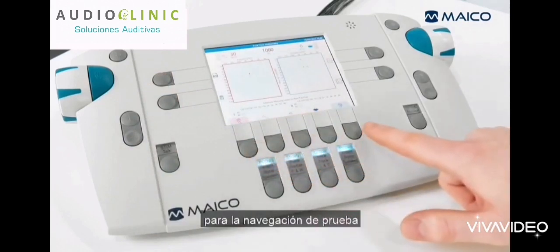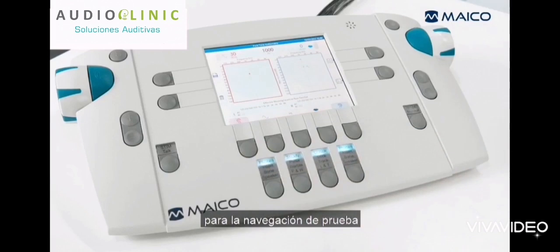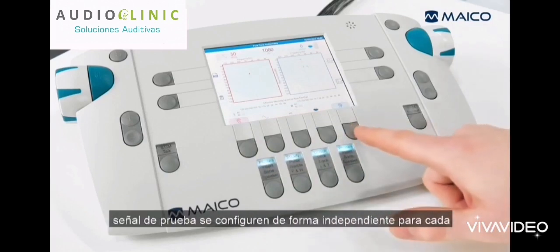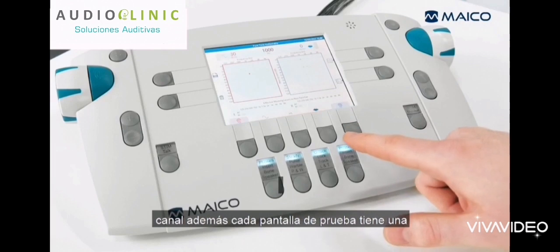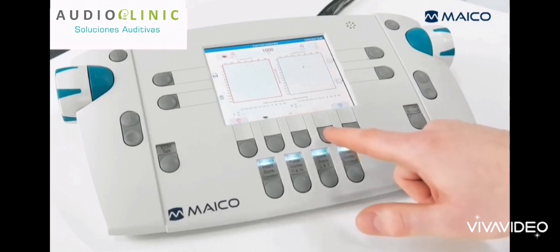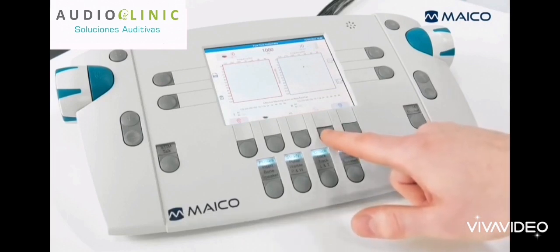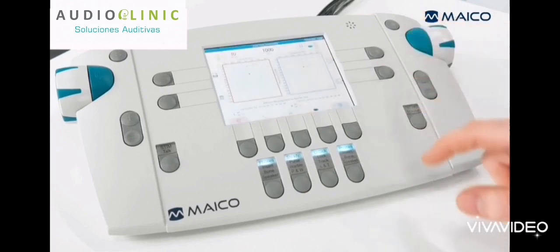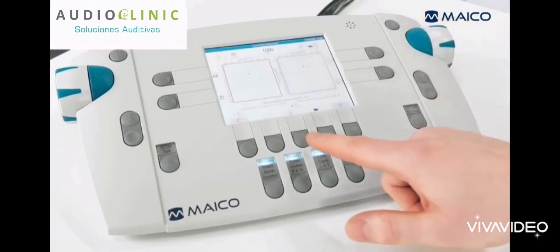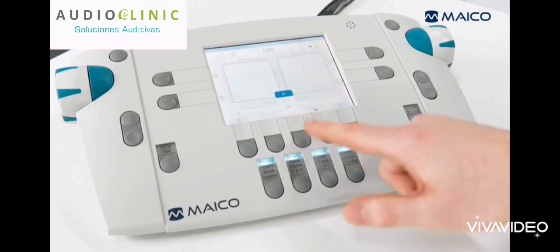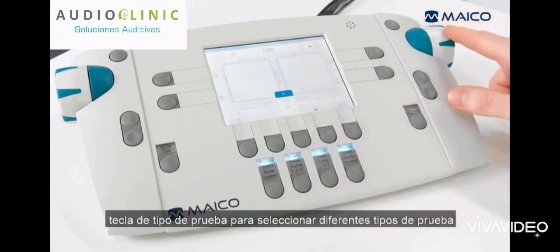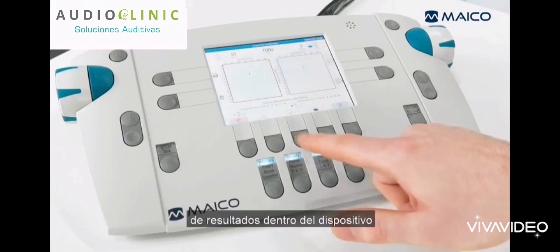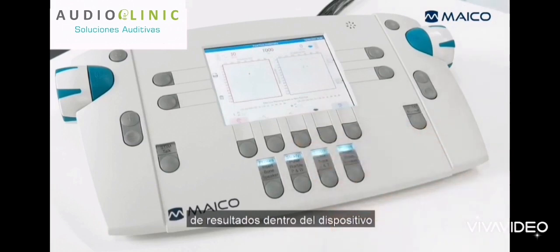The lower display function keys are used for test navigation. They allow the ear side and the test signal to be set independently for each channel. In addition, each test screen has a test type key to select different test types, which is important for correct storing of results within the device.